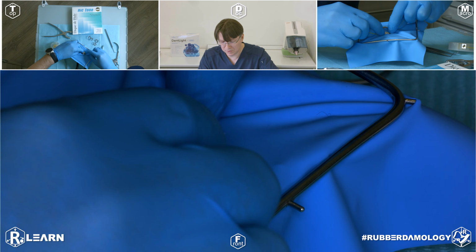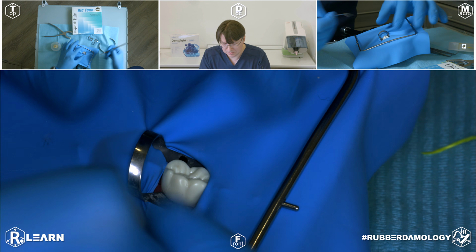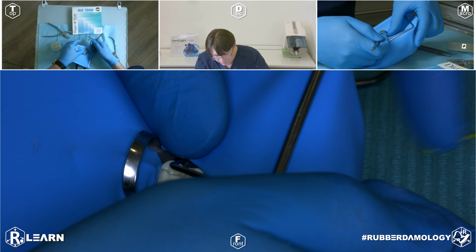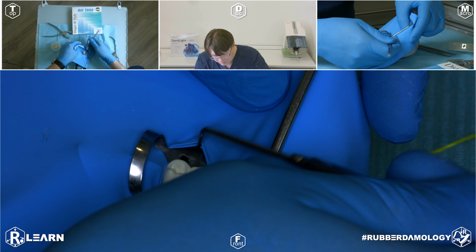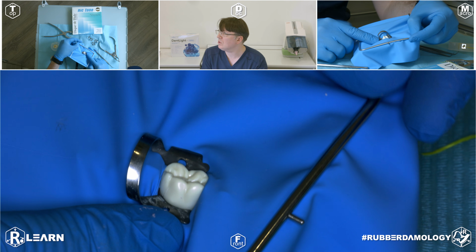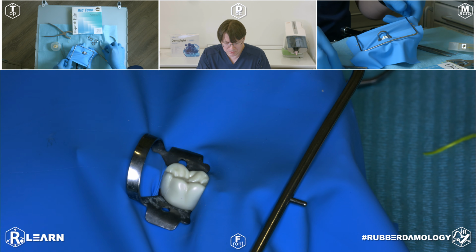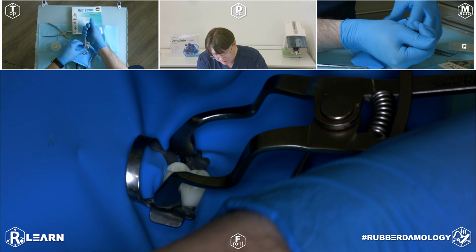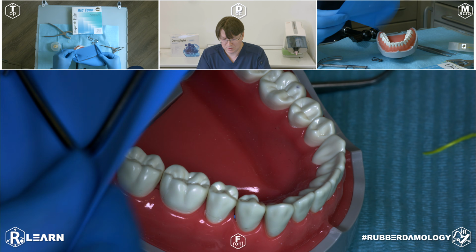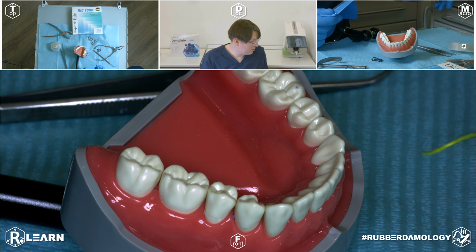If you need, invert into dental surfaces and release the rubber dam from wings of clamp. I think you can receive a time somewhere around 1 minute in real life to make all this isolation. Repeat for timing. Detach all our components. Remove rubber dam and repeat.